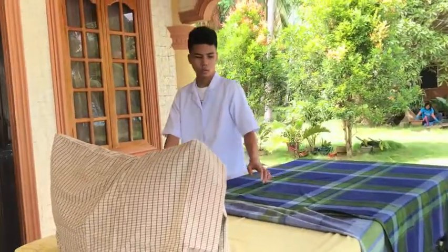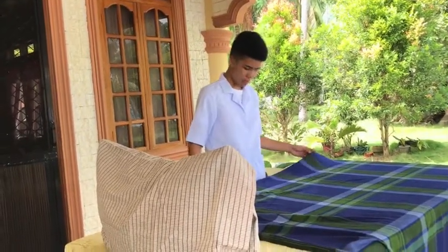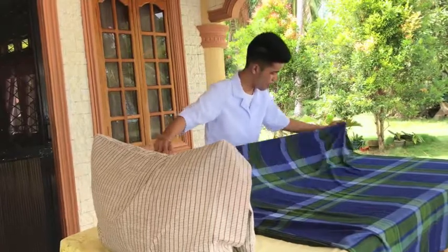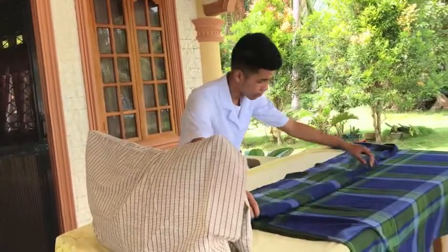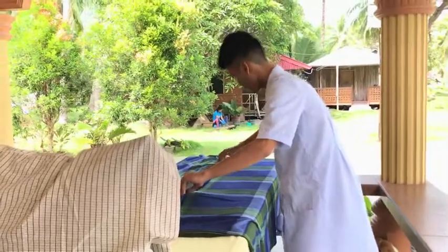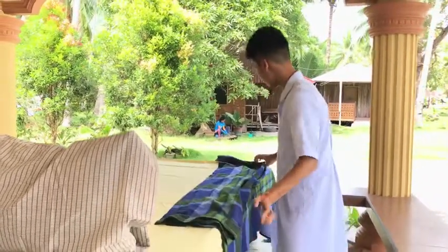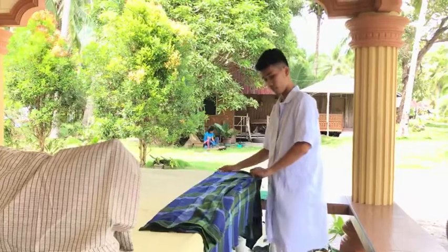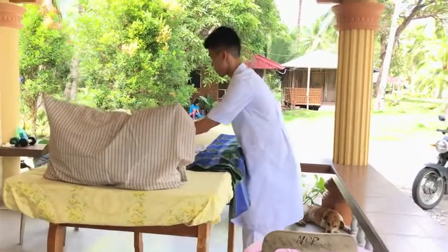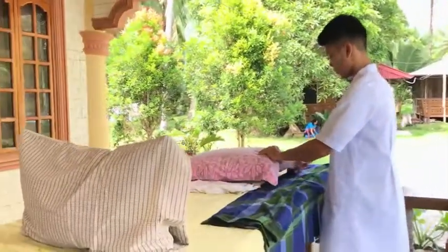The OB bed or post-lab bed is prepared when a patient is done with their surgery and has to be placed in their respective room. Roll the top sheet and place a waterproof pad on the buttocks part of the bed.